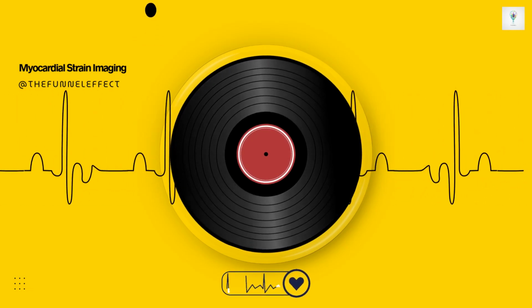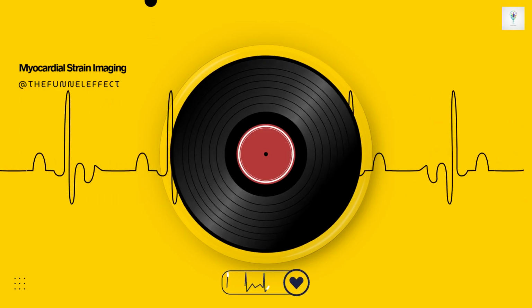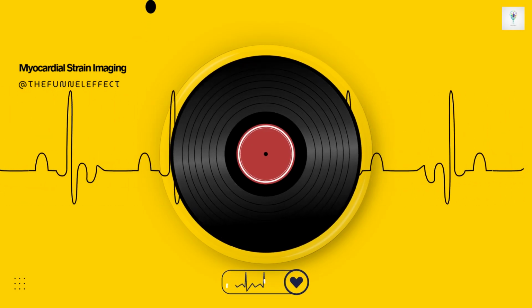Then you have the squeeze around the perimeter. Like tightening a belt. Exactly. That's circumferential shortening, measured around the short axis.